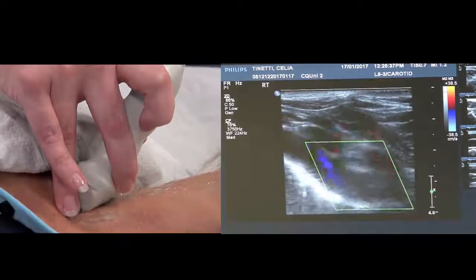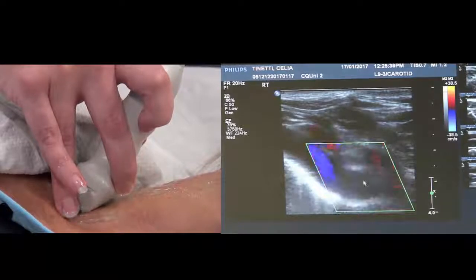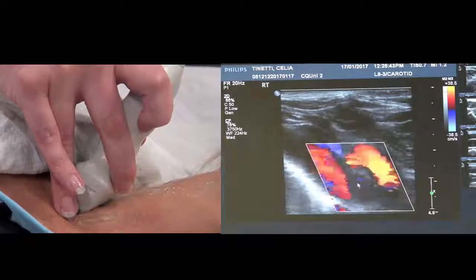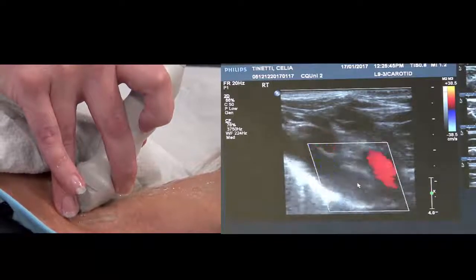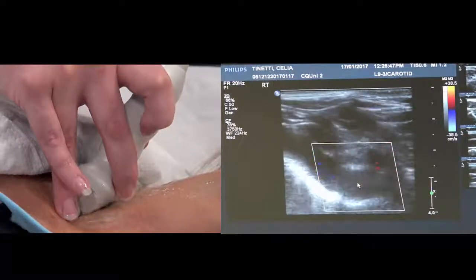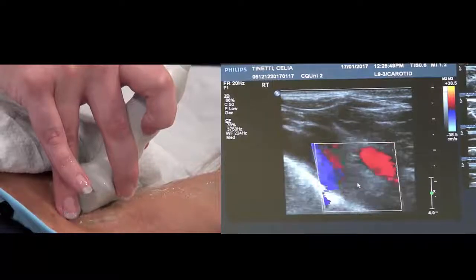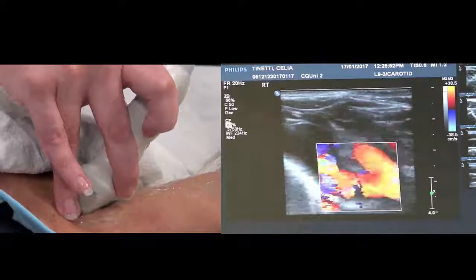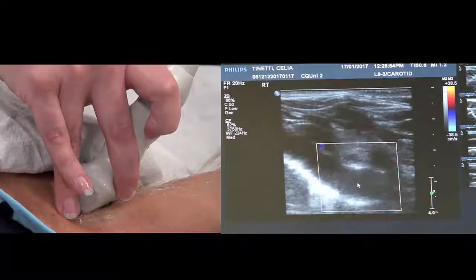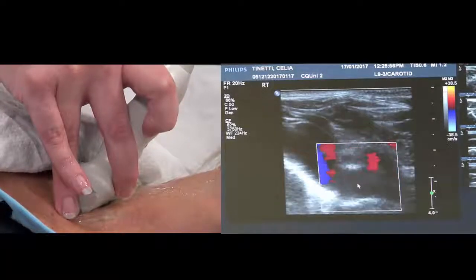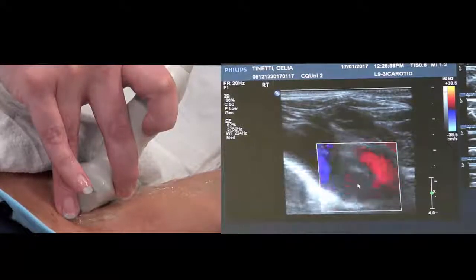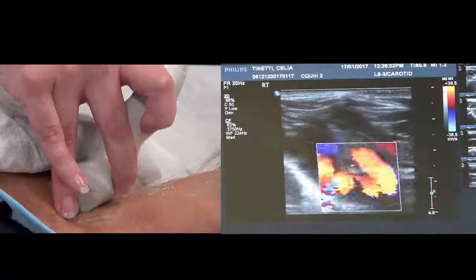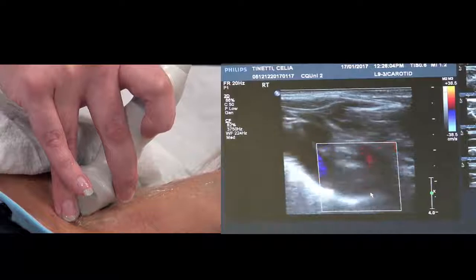For this person, that angle looks better so I'd put the color box there. Remember how I showed you before, there's no fill here. But if I straighten the box a bit, you should be able to get a little bit more fill. And if you put the color gain up, you should get a bit more. It's not a test for that, it's just an extra thing we do for carotids. If you can get flow through, you know there's not an obstructive plaque there. So do the best you can, don't stress over it.